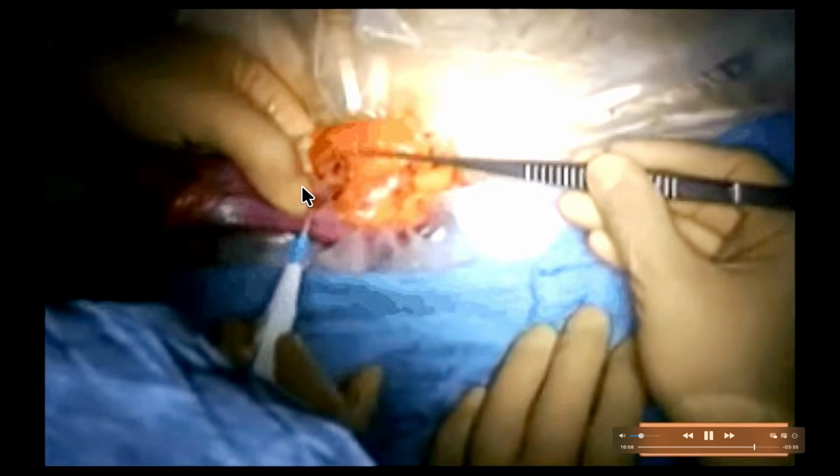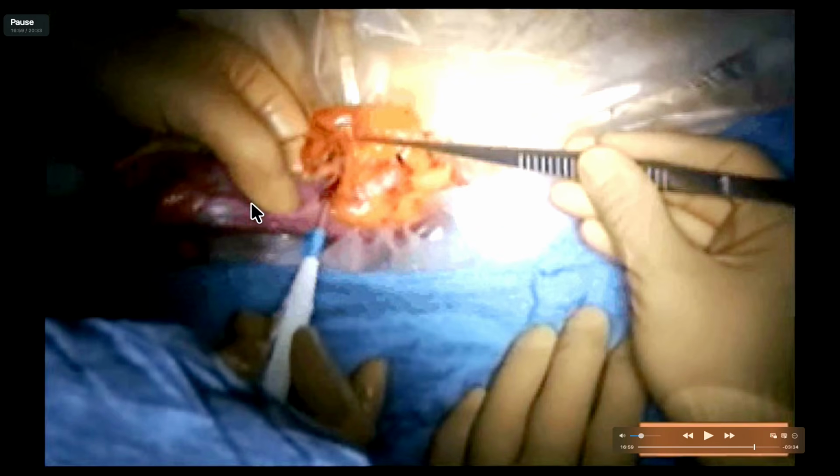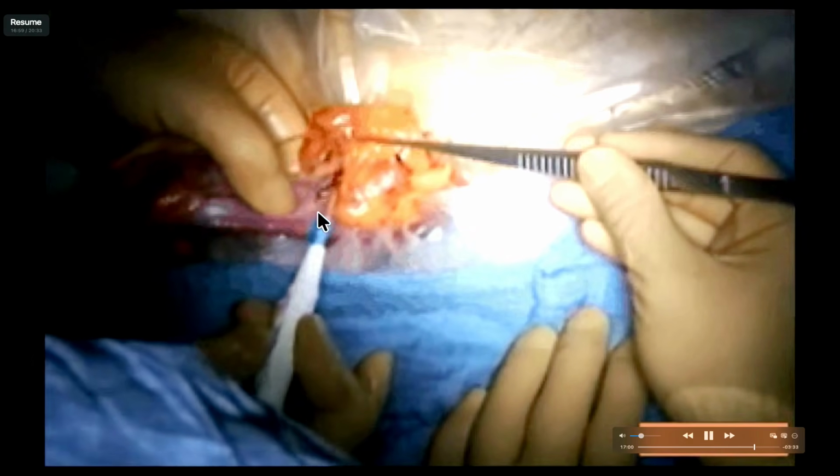Otherwise, it will cause anastomotic leak. So all this fat you should shave out, and it is out. And after that, once it is shaved, this side is sigmoid, this is descending colon.